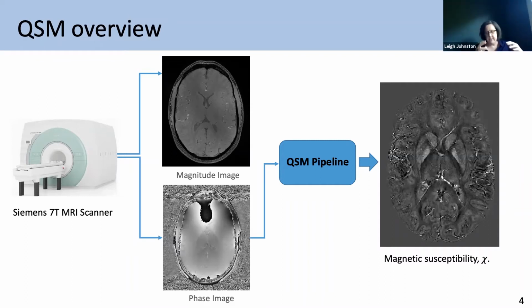At 1.5 Tesla and 3 Tesla, the magnitude was the only thing that actually made sense. It's the only thing that gave the beautiful anatomic information. When you get to 7T, however, the phase image, literally just the phase of those complex numbers that are the signal being read off at every point in time, actually has detailed information in it. What the phase image tells us about is literally the off resonances: how fast or slow, relative to the bulk magnetization average as it returns to equilibrium, is the phase within a particular voxel, a volume element that we're imaging.